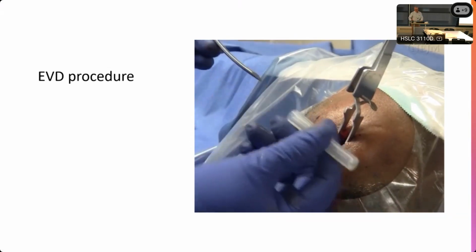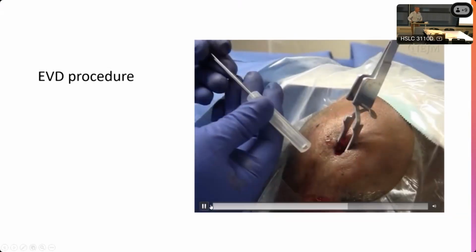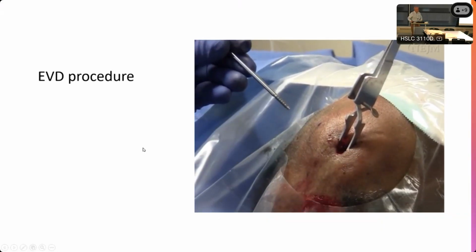Next, remove the protective caps from the trocar. Advance the trocar.